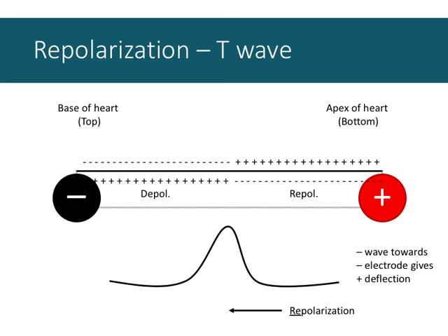Some repolarization is hidden. That's what Dessa pointed out. It's absolutely true. This is a small part of what we can observe through a basic lead 2 ECG. Being that it's a small part, we need generally silence from the rest of the heart, and that happens sometimes but not always.